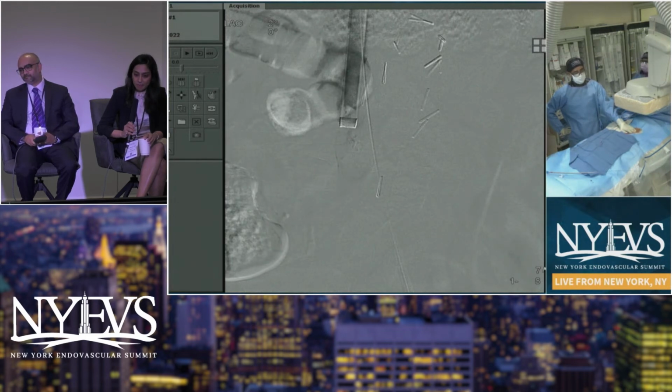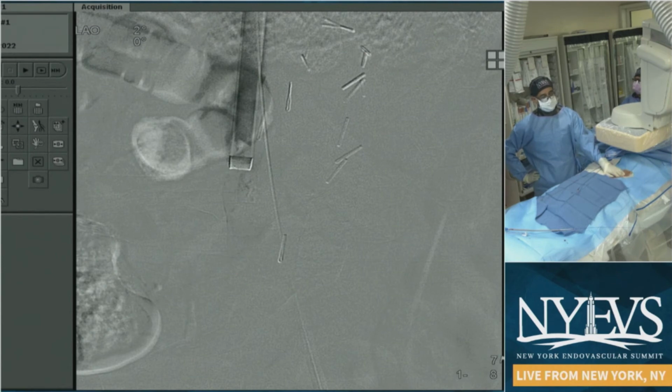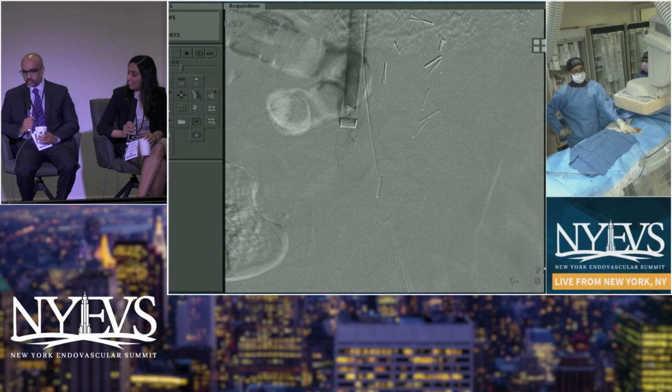Yeah, the Greenfields are interesting. I haven't had a problem with the stainless steel Greenfields. We've seen issues with the nitinol Greenfield, the one with the wavy legs. There are a lot of contact points there. So for those, what we've been doing is, once you grab them with the forceps, you push them down a little bit to disengage the legs, and then we pull them into a dry seal. It works really well to pull them into a 20 French dry seal.